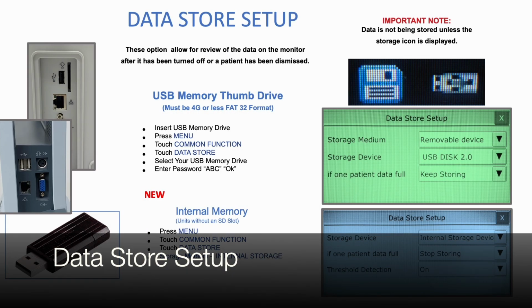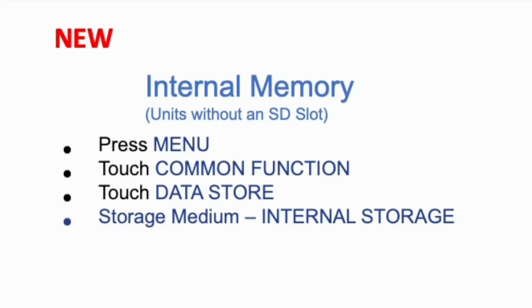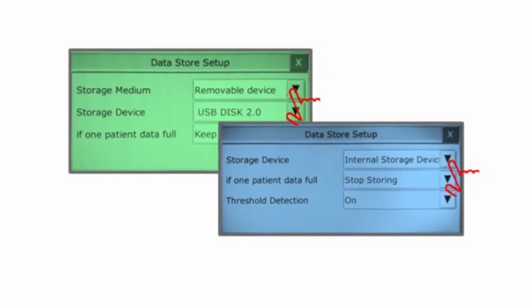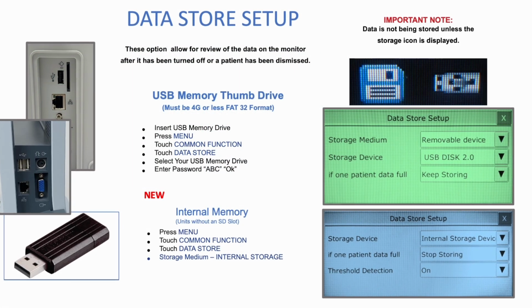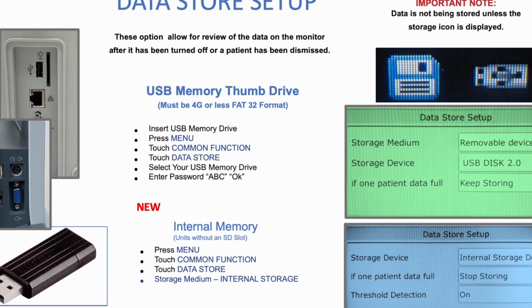Data Store Setup. The newer versions as of 2022 have two options for storing data. Press or touch Menu, touch Common Function, touch Data Store. Touch the arrow to the right of Storage Medium to determine if your monitor is equipped with internal memory. If internal memory is an option, choose internal memory. If it is not equipped with internal memory, insert a USB memory thumb drive into the USB slot.